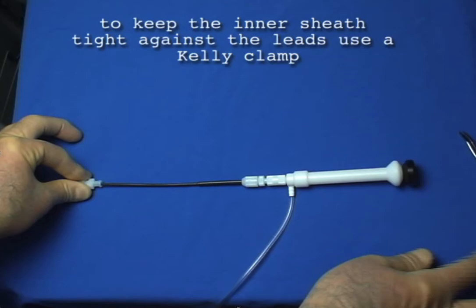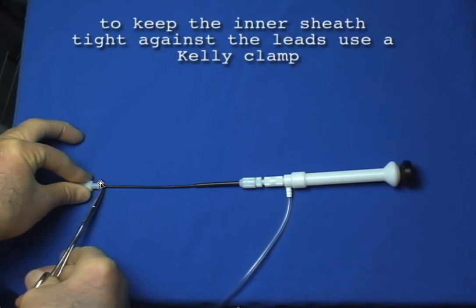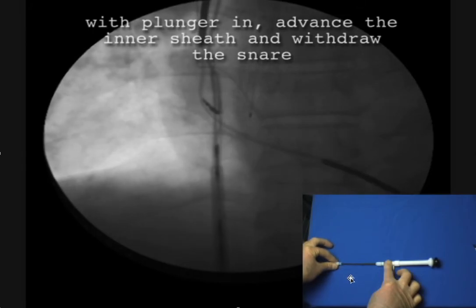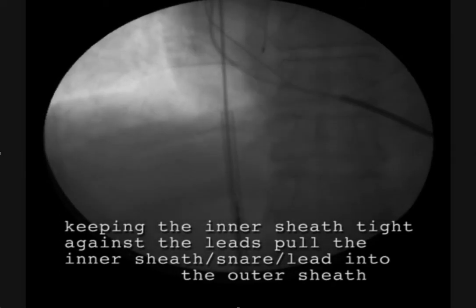like that. Okay, now, the second big mistake I made was to inadvertently slide this back. And it's very easy while you're tugging on the lead to slide this back, which then releases the lead. And to prevent that, I now take a Kelly hemostat and lock it in place. Once I've successfully snared the lead like this, you want to make sure that this inner sheath stays up tight against the lead. And if you don't... in that case we did it, we kept it nice and tight.